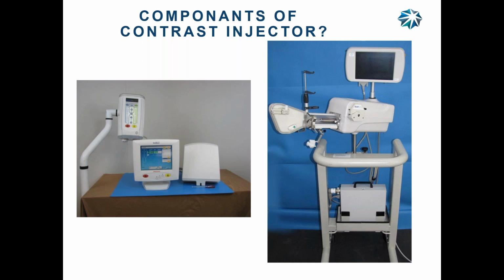Who controls the flow rate? He does all of it, and doctors love control, right? So they have a hand switch about this size, and you have to calibrate it every time. You switch it out, and you have two buttons, air buttons, and you push it, and it'll inject, and the doctor can slow down the injection, speed up the injection, slow it down, and then when the syringe is empty, what happens? It auto fills.